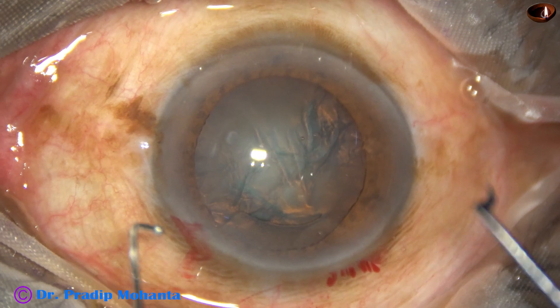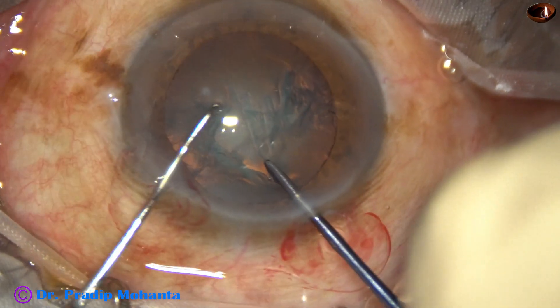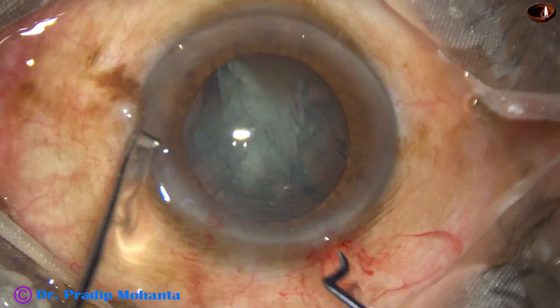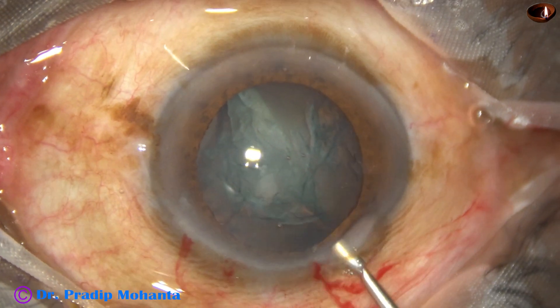The anterior chamber is filled up with visco again. And then a pre-chopper is used to divide the nucleus into fragments. I just divided the nucleus into 2 hemi-nuclei.